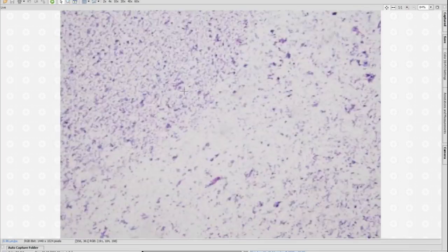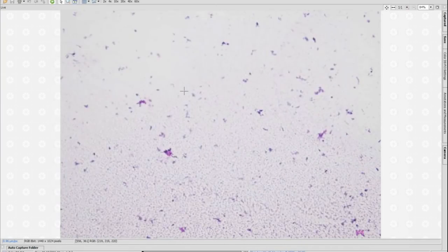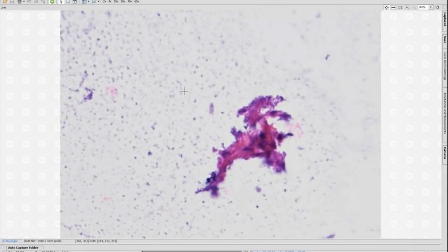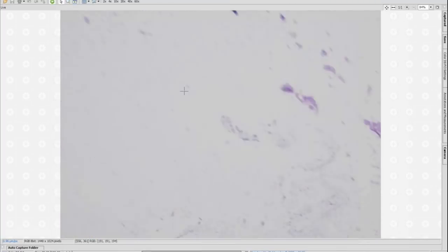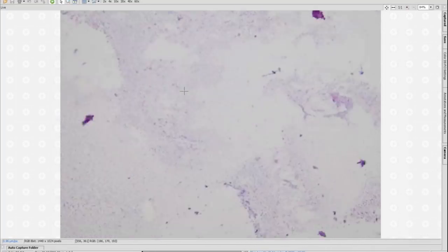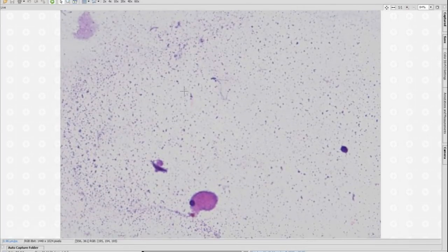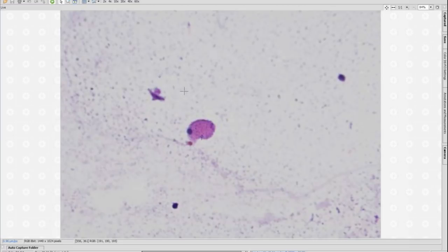This was actually a very challenging frozen section. We had very small pieces to start with here, and to show some of the very tiny fragments. We have scattered cells like this, and this was a very nice clue actually. Large cell with eosinophilic granular cytoplasm.